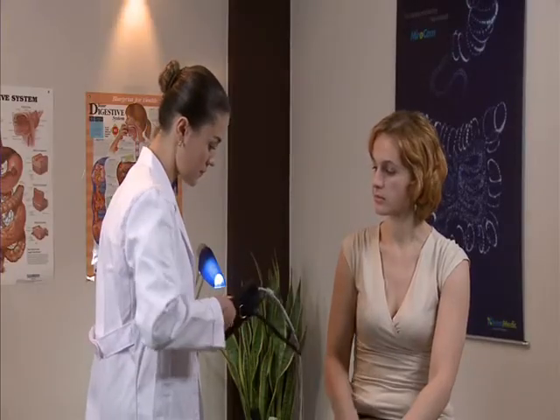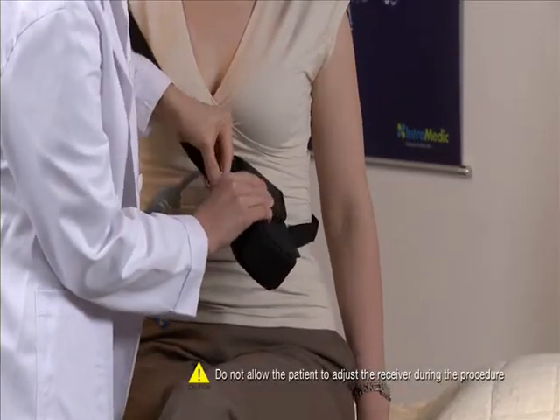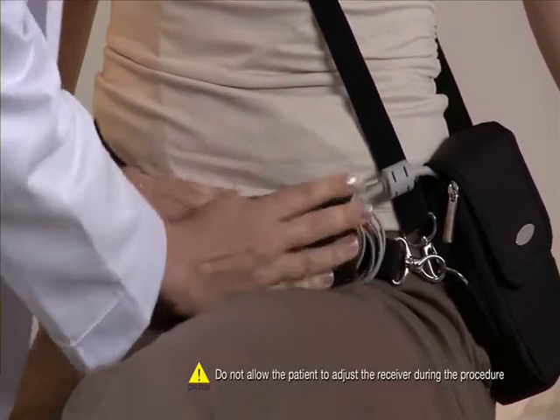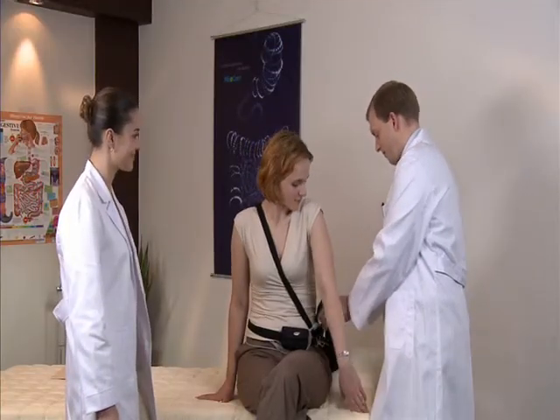Place the receiver in the receiver bag and adjust the straps to ensure the patient is comfortable. Place the excess cables in the cable bag. After completing ingestion of the capsule, the patient should be informed what to do during the procedure.